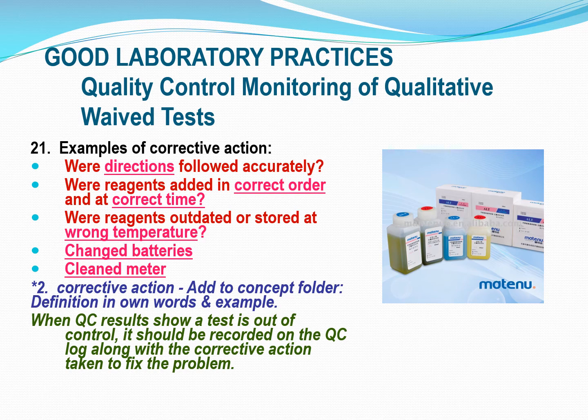But what they want to see is that your QC was out of range. This is the corrective action that you took. This is where you got your reagent to come, your controls to come in range, and then you started testing with your patient. This shows accrediting agents or people that come in and look over your results that you know what you're doing. You're actually running it.